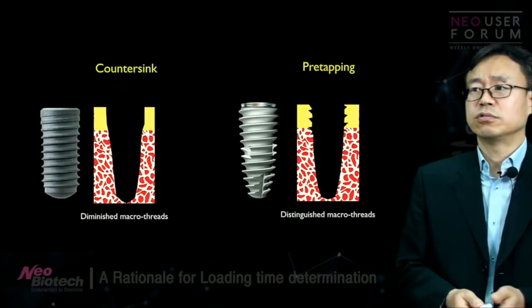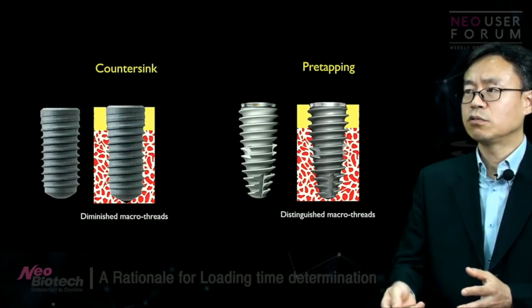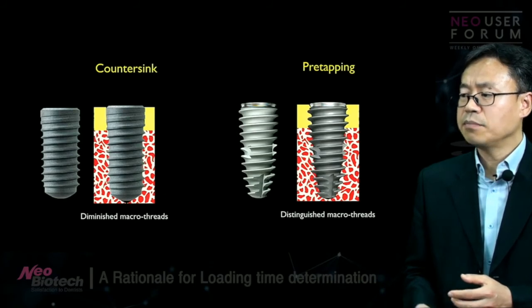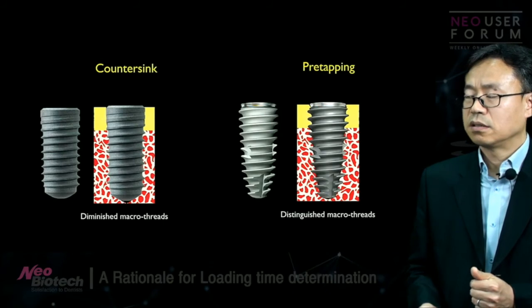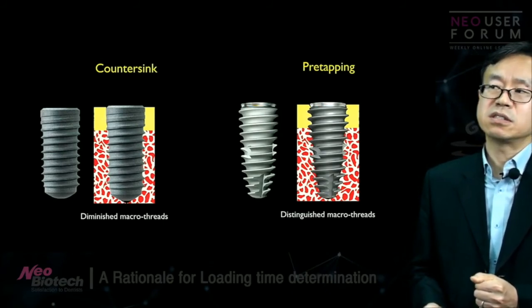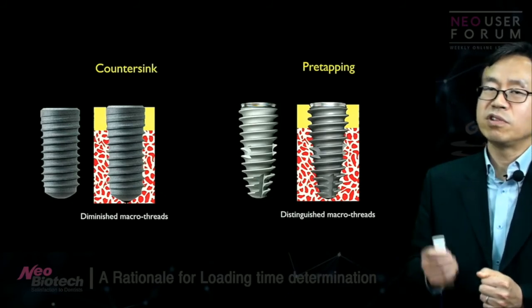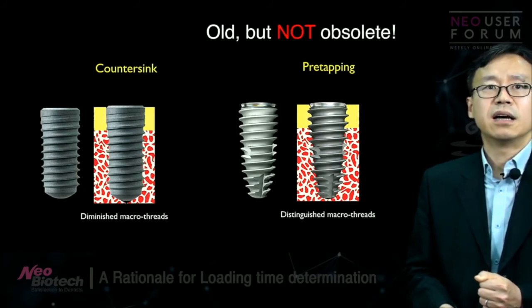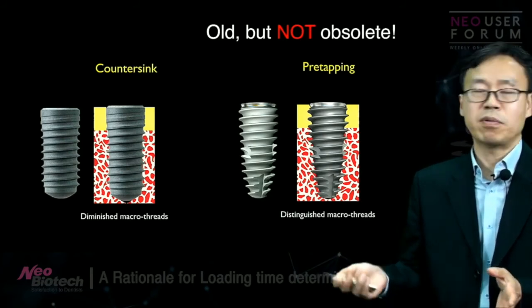We also used something called pre-tap, which is shown on the right. Not many implant manufacturers still have this though. It may be an old concept, but I really believe it's a brilliant idea to get really good primary stability. I don't really understand why many implant companies gave up on this.